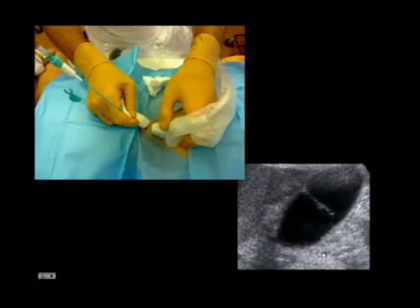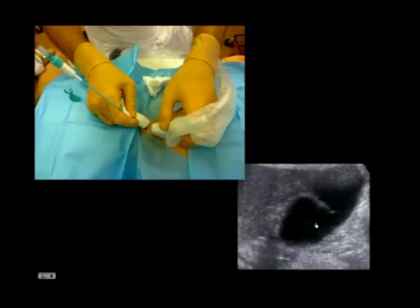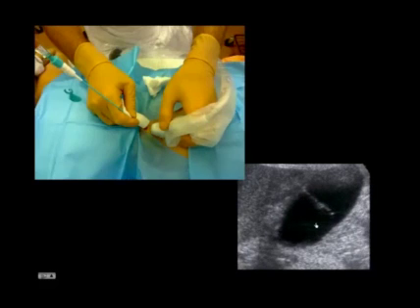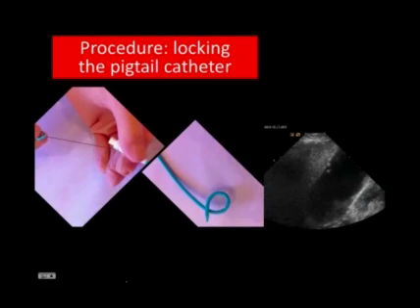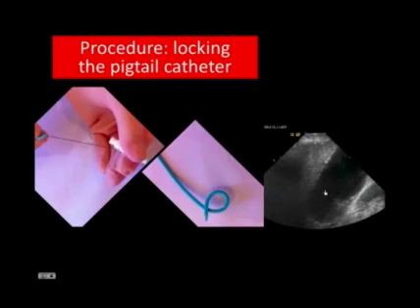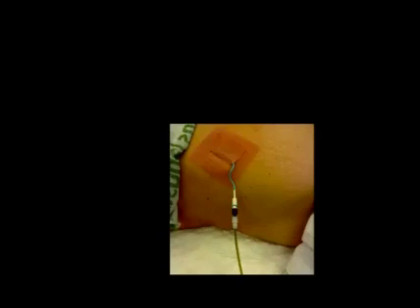Sometimes the gallbladder wall gives an elastic and persistent resistance to catheterization. This resistance must be overcome with the right amount of force, taking care not to puncture the opposite wall. Once the catheter is in place and the metal stiffening cannula is removed, by pulling the wire the coil is locked. The catheter with the locked coil is then gently pulled to allow the gallbladder to firmly adhere to the liver surface, preventing bile leakage through the insertion hole. The bile can be aspirated by syringe or connected to a collecting bag, while maintaining gentle traction to minimize mobility of the gallbladder.